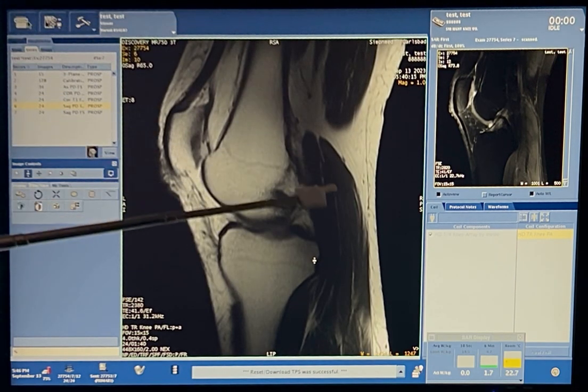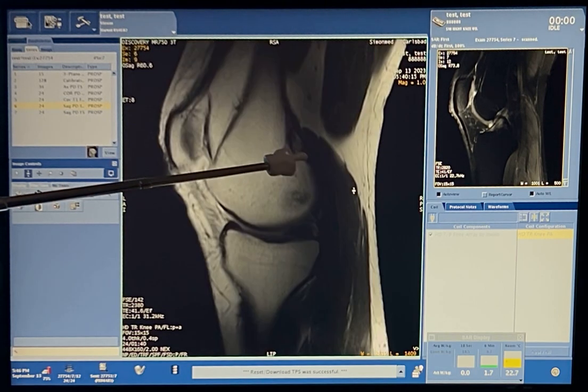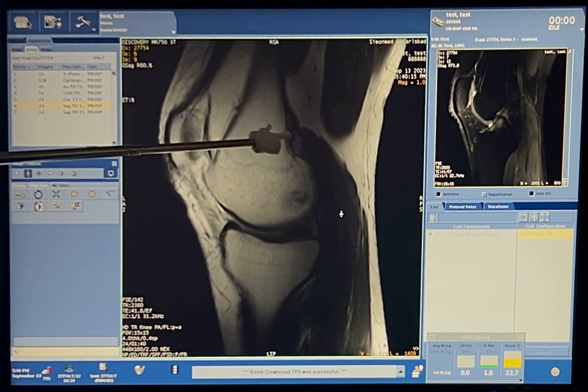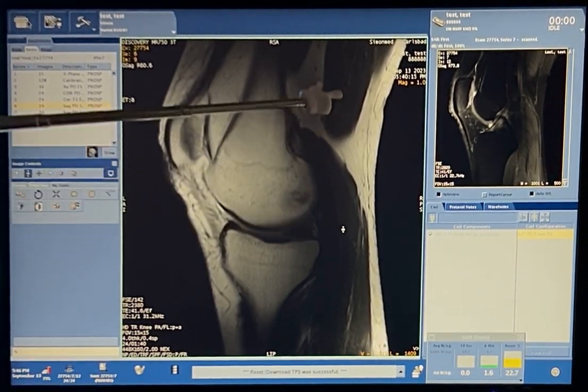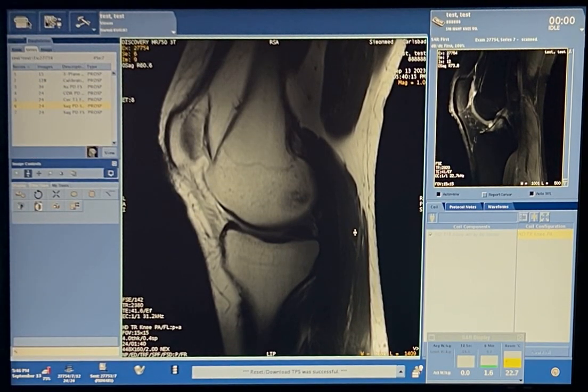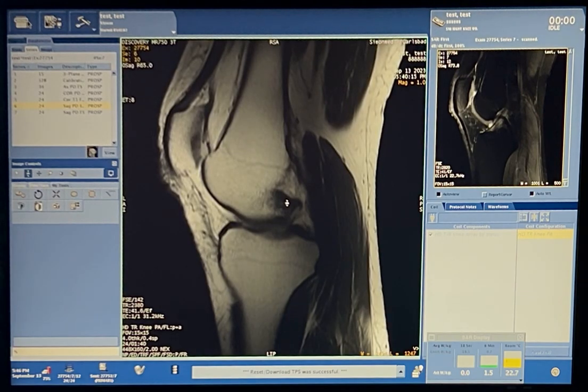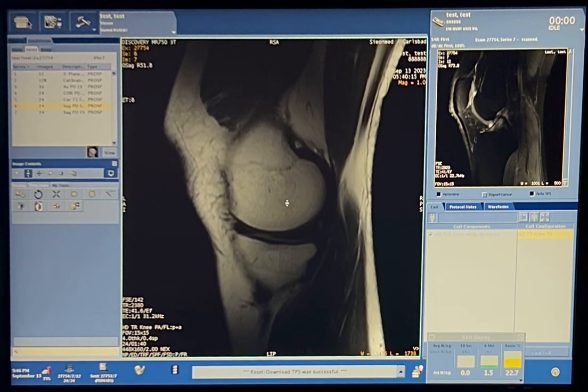So you can see how it comes up. Yeah, keep going. Calf muscles, soleus and gastrocnemius, and they insert right up here, right above the femoral condyles. Biceps femoris of the hamstrings. And yeah, can't really think of any other structures. Go back to midline for this, or not midline, but you know, the money slice.